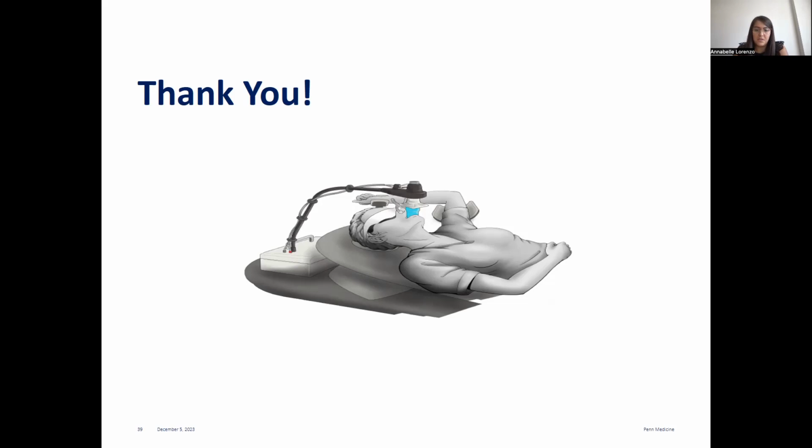Do you encounter the situation where the SDX system shows that the breath hold level is within the window, however, imaging shows that the diaphragm is off, perhaps due to a change in the patient breathing since the SIM? I would say yes, that has happened. And usually if that happens, we call the physician over to the machine to look.